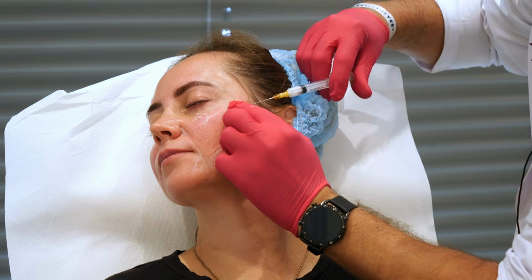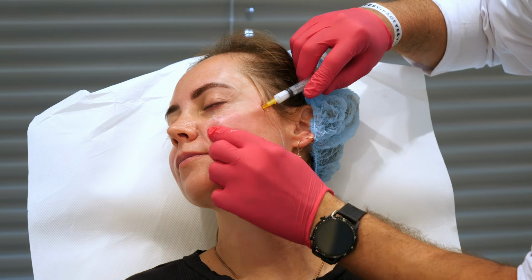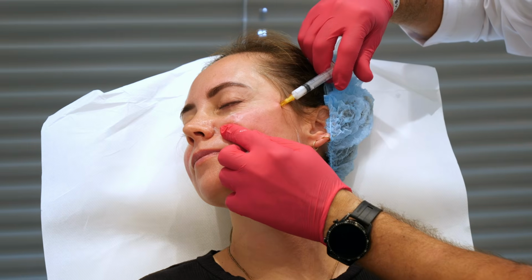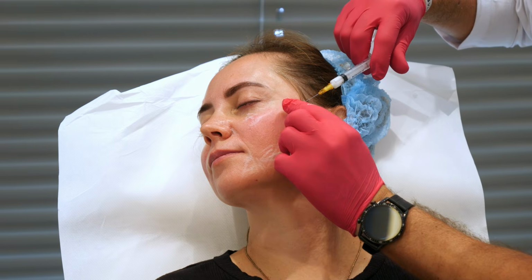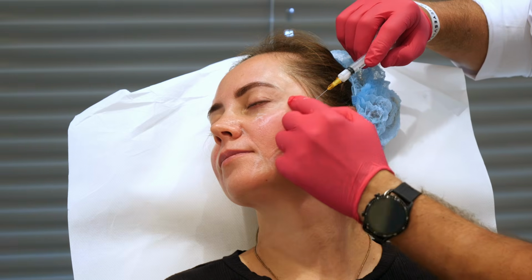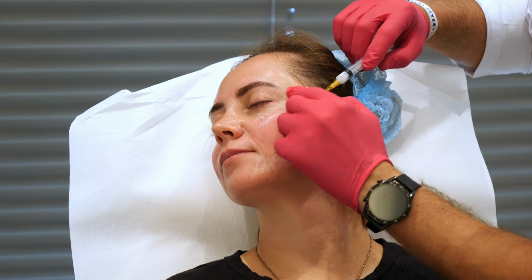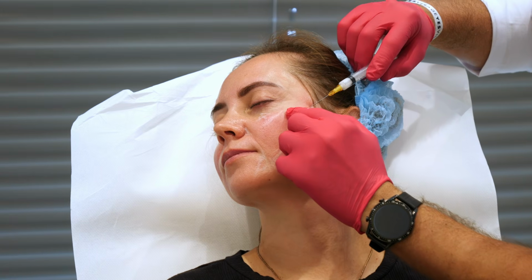So, another. With these vectors, we work another zone with the wrinkles, fine wrinkles here.